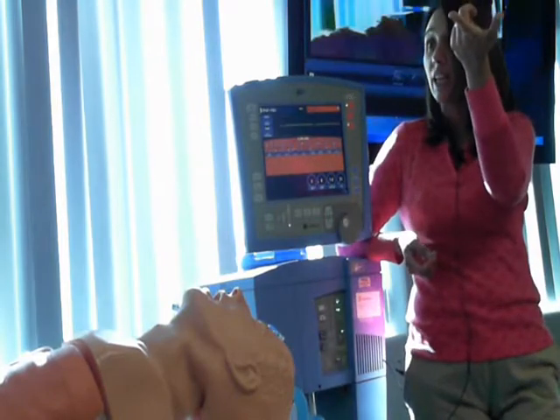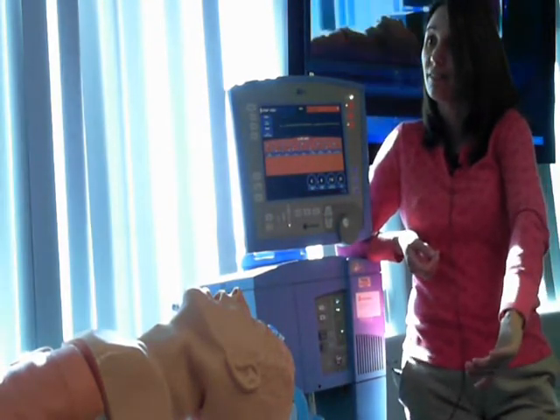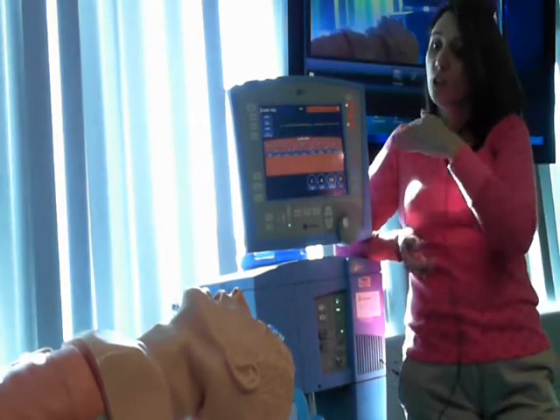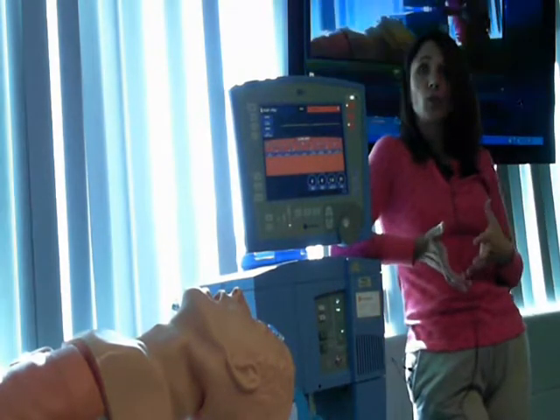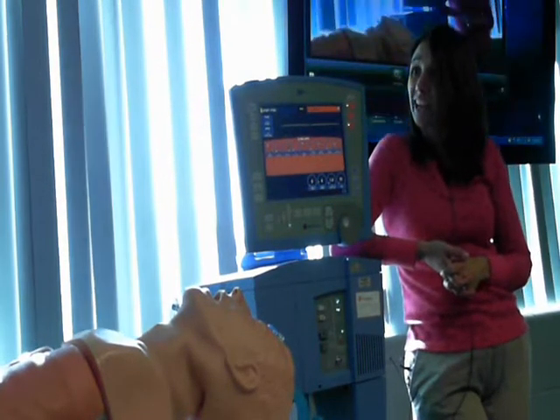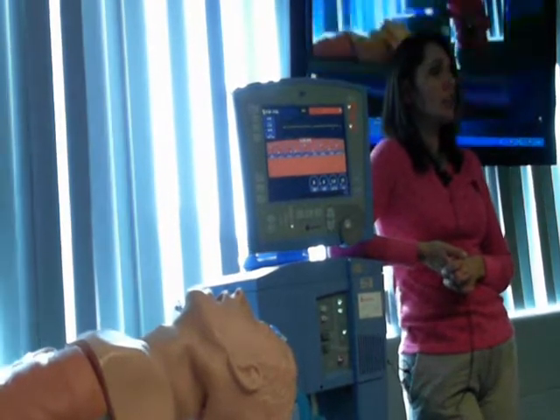But he went on TV, and they put his vent underneath his chair. And there are speaking valves that can go on. So you can deal with that. Your goal is to try to have them regain as much muscle strength as they can as their injury heals. Did that answer your question? Okay. Anybody else? You guys have some really good questions.